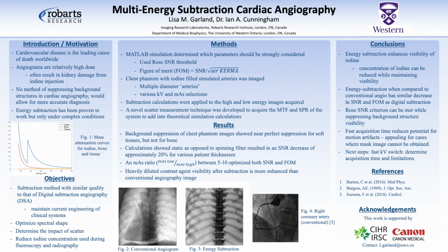The Rose SNR criteria was used to ensure that small structures would be visible in various simulation parameters.